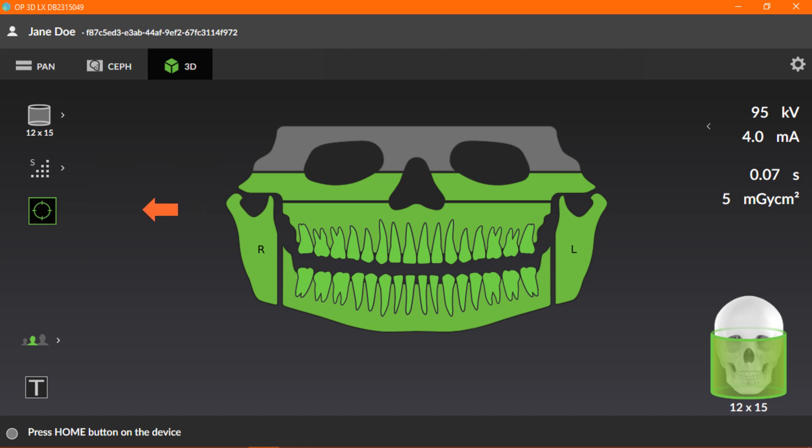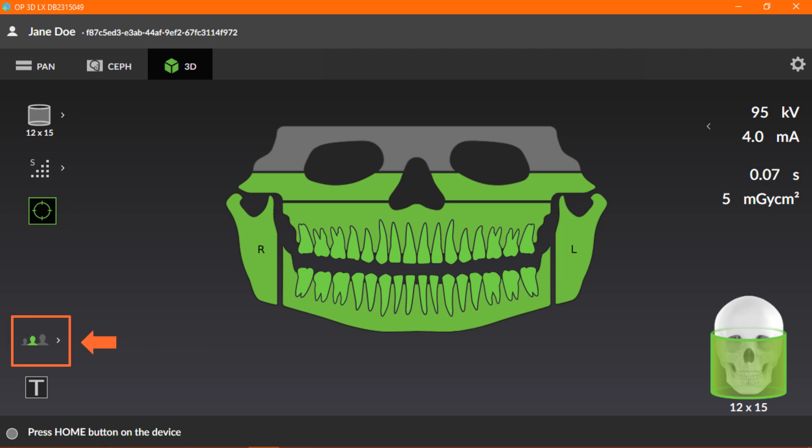The next icon is used for capturing a scout image. We'll cover this section later in this course. Now, let's look at the patient size selection icon. To change the patient size, click the icon.